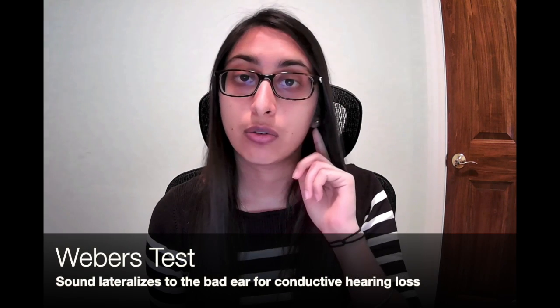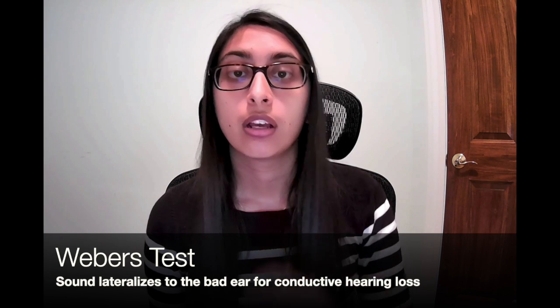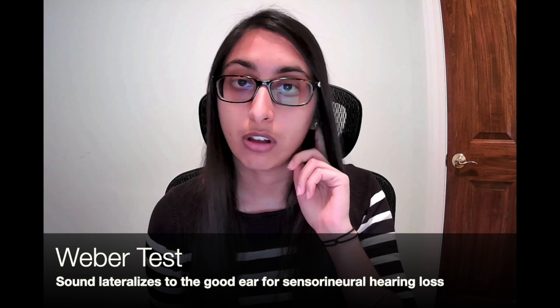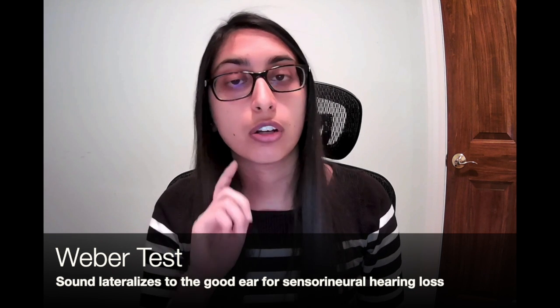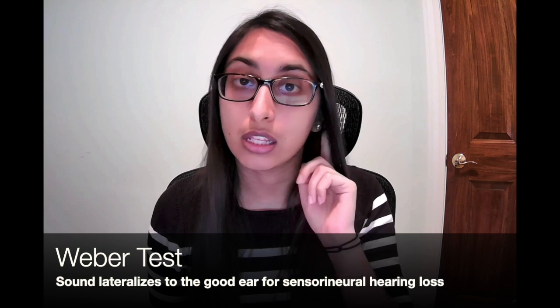In a Weber's test, you're going to take the tuning fork and put it in the middle of the forehead here. Now, let's say I have hearing loss in this ear. Once I put the tuning fork here, you're going to ask the patient, in which ear do you hear the noise better? If I hear the noise better in this ear, that means I have conductive hearing loss in this ear. Let's say I do the test again in another patient and they say they have hearing loss in this ear, but they're able to hear the sound better in this one. That means I have sensorineural loss in this ear.